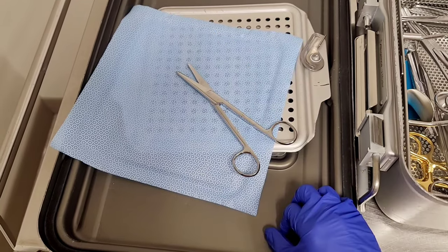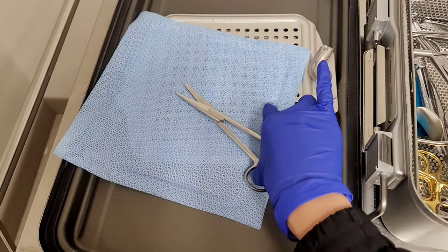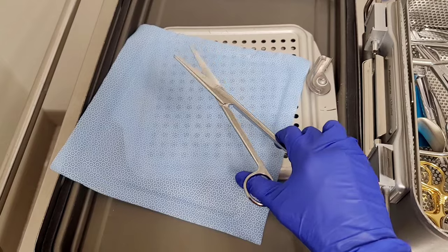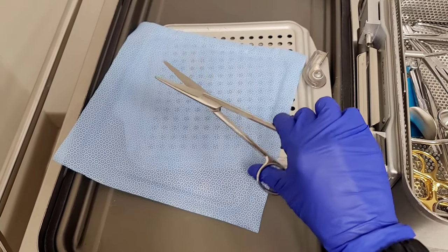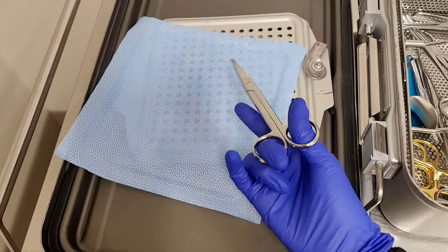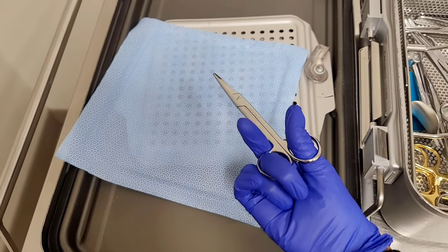The second method is grabbing it like this and using this finger and this finger here. It's getting better when you cut suture, but this is still really uncomfortable and you still have very little control — it's pretty wobbly, especially if you don't put this finger over here. It kind of hurts too, so this isn't the best. It's okay, but it's not the best.